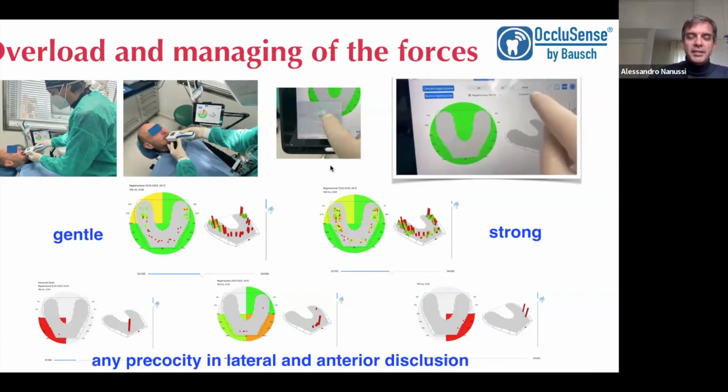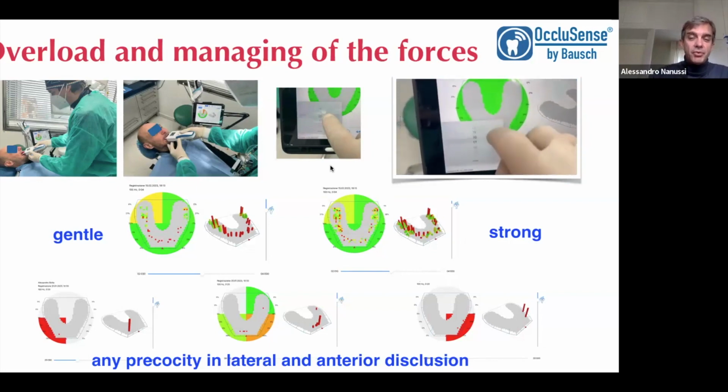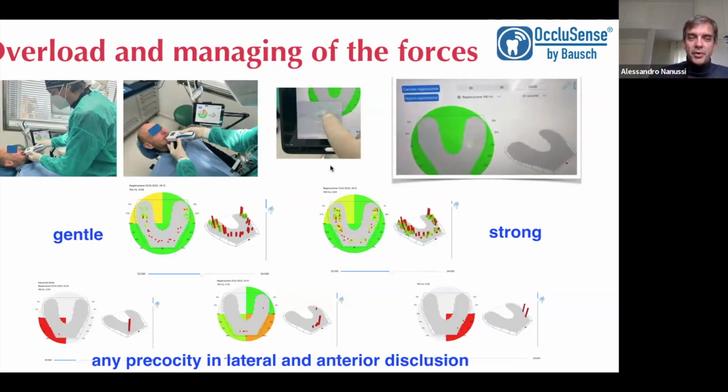If you select an exam of 20 seconds, because you need so much time to check the disclusion, lateral and anterior movement with your OccluSense, with 20 seconds you can check lateral precocity and anterior disclusion. And you can see that after positioning my restoration on the patient, I have on the right side a perfect canine guidance. So I'm not worried about my restoration, my onlay in disilicate, because this restoration is protected by the canine guidance. I didn't expect it in a grinding patient. I was expecting a group function. No, he also already has his canine guidance on the left side.